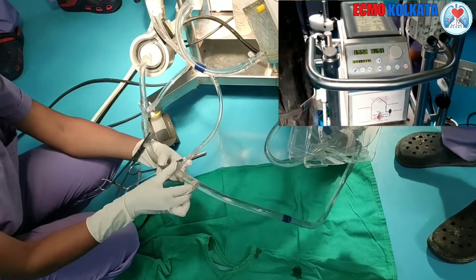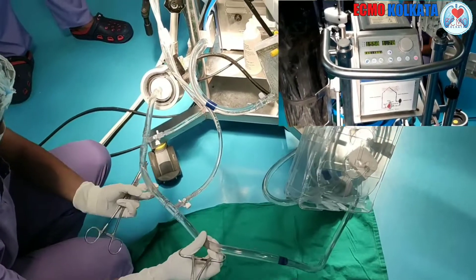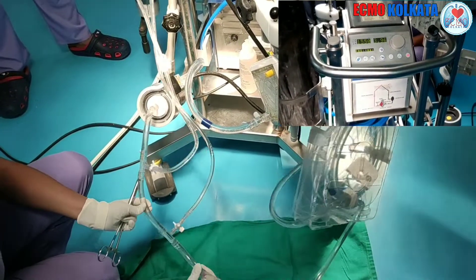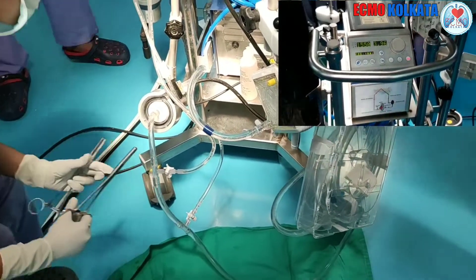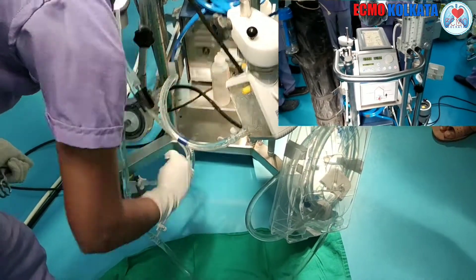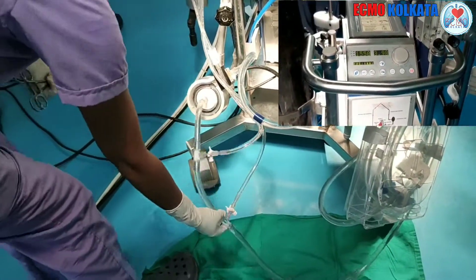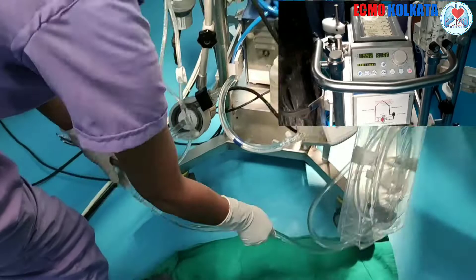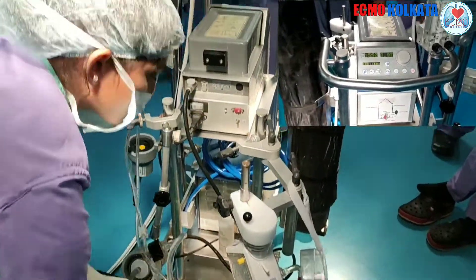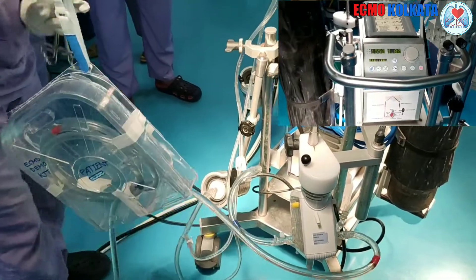As there is no bubble at that position, we remove the clamp slowly. The flow is increasing. As soon as the whole circuit is de-aired, the quick prime port three-ways are closed. Now the fluid is moving inside the circuit only.